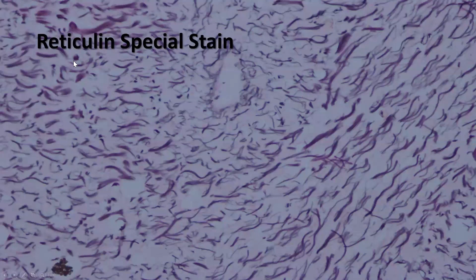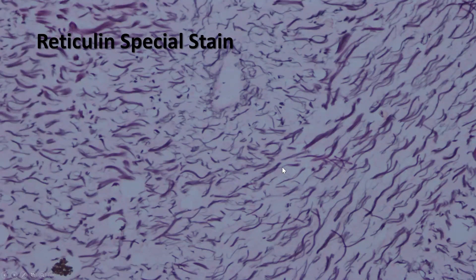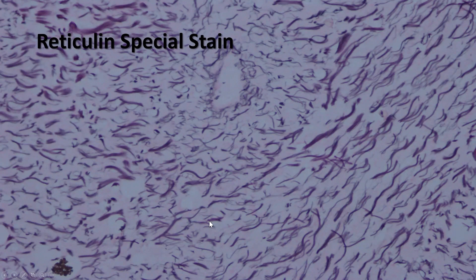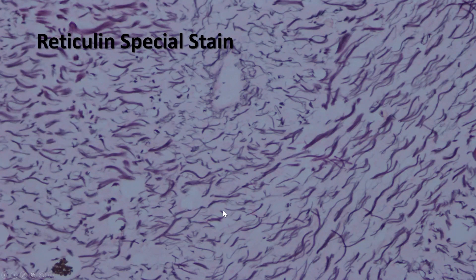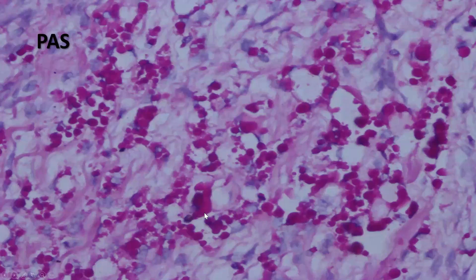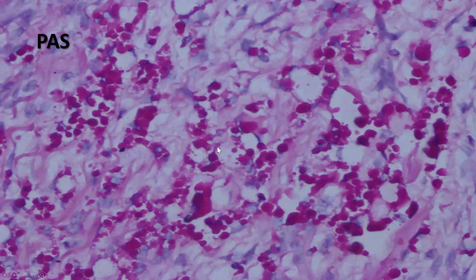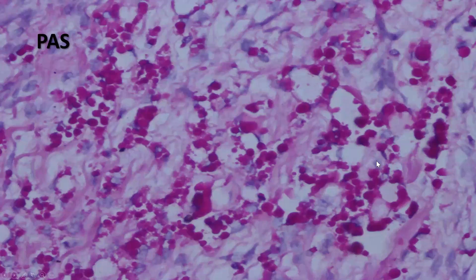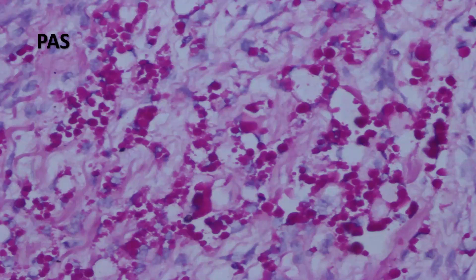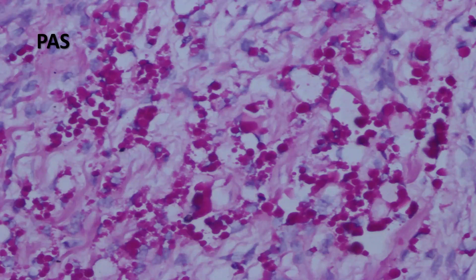Reticulin special stain is very helpful because it shows really increased reticulin deposition, sometimes even investing individual tumor cells. The PAS stain would further highlight the globules, providing additional supportive evidence of this tumor type.